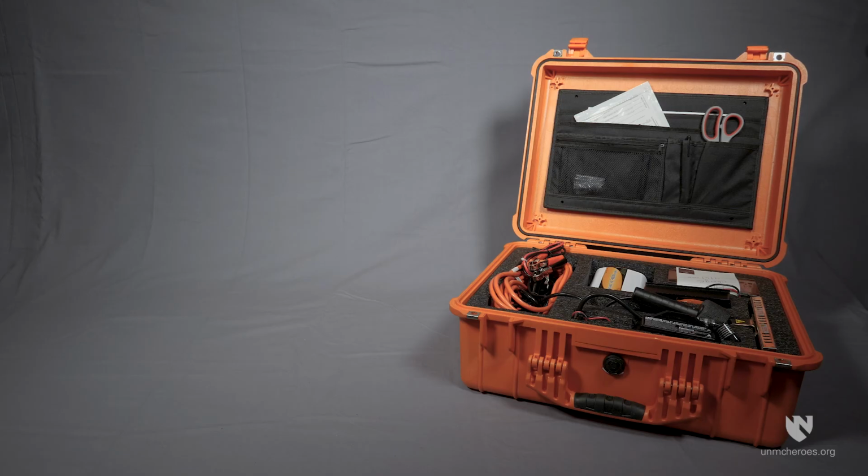The following is a brief overview of the assembly and use of the BioSeal portable system. Please refer to the manufacturer's instructions for use for more specific information. As previously stated, there are 3 different methods for setting up the inverter for use when AC power is not available.